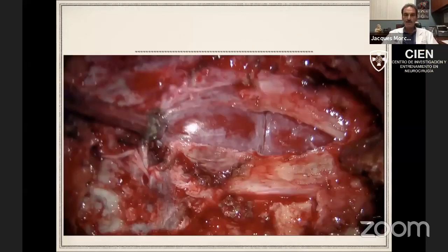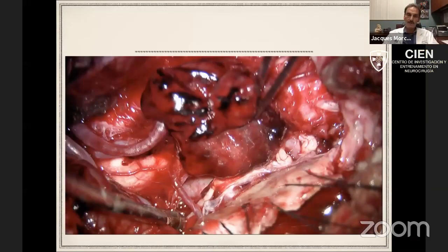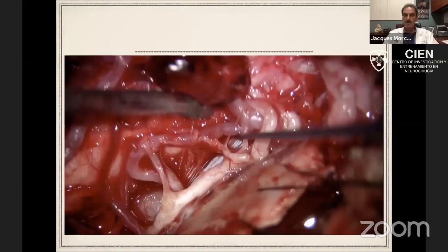Look at this aneurysm. Simple laminectomy because it's low down, and it's a double origin PICA. Here is one origin. Here is the other origin. Very strange anomalies, these double origin PICAs. Here is a clot, measuring the flow. Look at those perforators to the medulla. If you had done this endovascularly, you could end up with a medulla or upper cervical cord infarction.